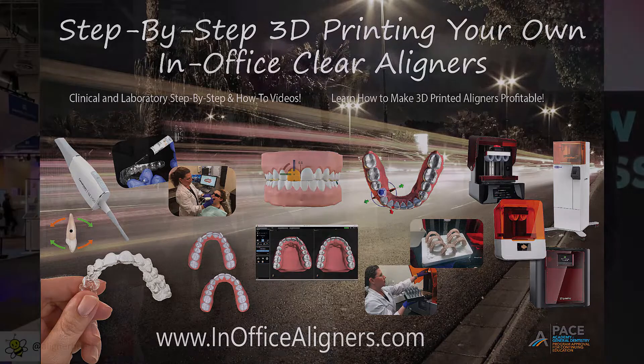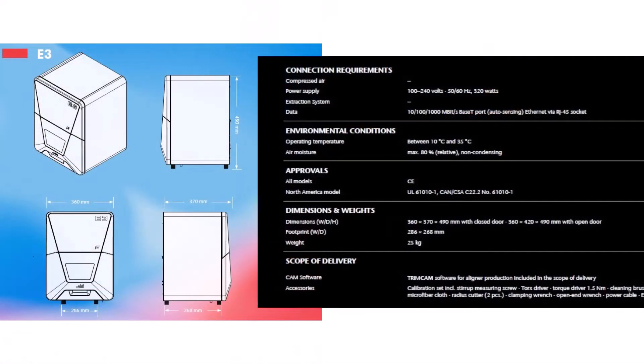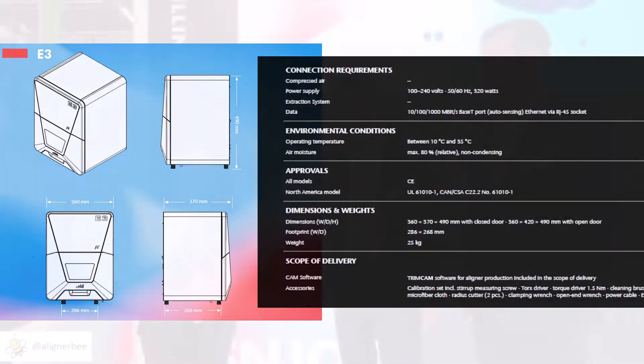Let me begin by introducing you to Nicholas Rohde and Fabian Spangler, who are here from VHF. They're going to walk us through their new mill, the E3. The E3 is a mill specifically designed to trim clear aligners in-office or in a laboratory. As you can see here on the counter behind me, this is a very small mill — great for the in-office clear aligner workflow. It only weighs about 55 pounds.